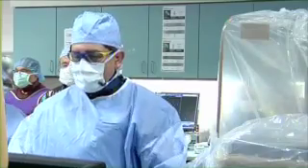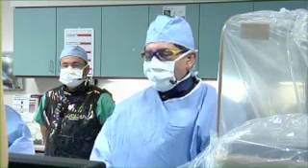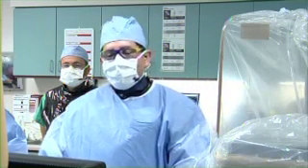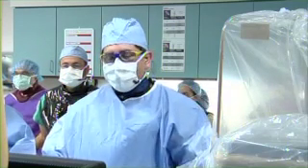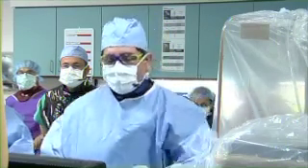Ramon, tell us where you are in the cath lab and a little bit about your patient. Yes, thank you, Jonathan. Good afternoon, everybody, or morning or evening, depending where you are. Welcome to Cardiac and Vascular Institute. This is our cath lab. It is not an operating room. This is an endovascular suite, meaning that we do procedures here based on imaging and not by incision.